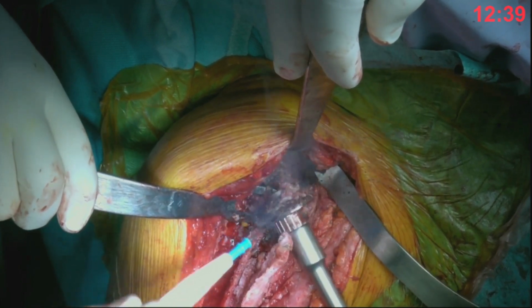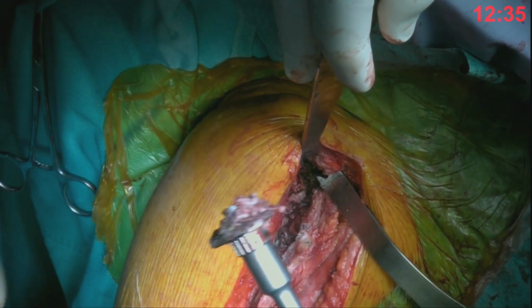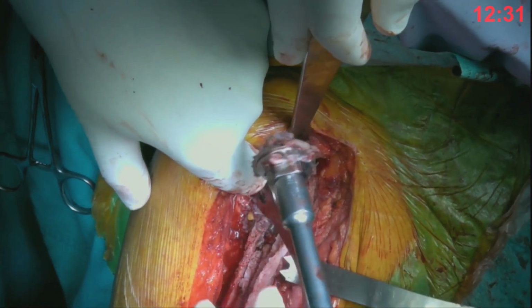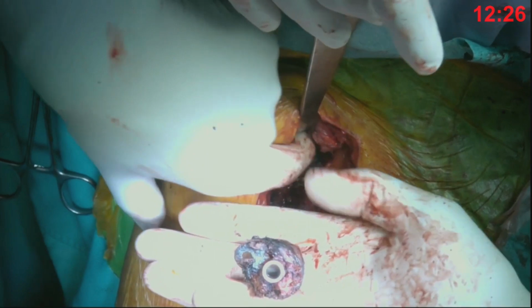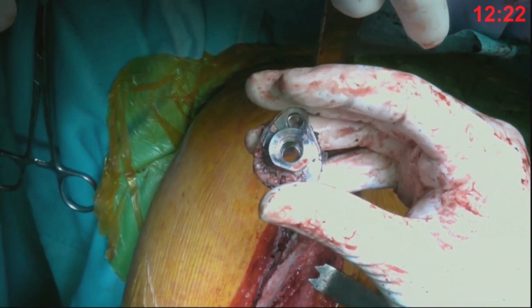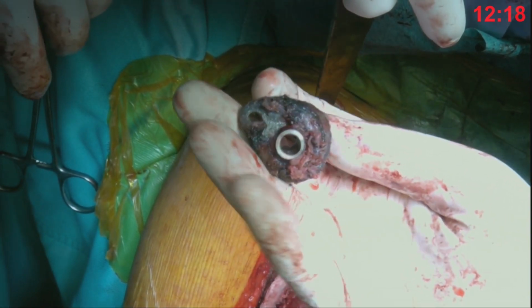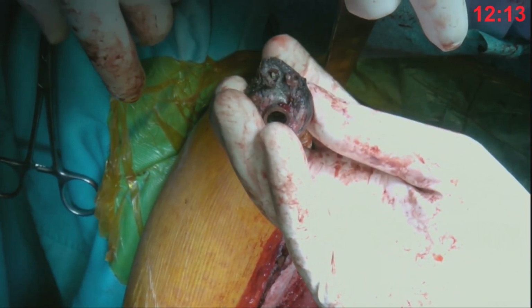And what about the screws? If you have the X-ray in mind; otherwise I show you the X-ray again. There are the tips of the screws that are broken and are in the bone. Because of the risk of unexpected infection, do you look for all the tips and try to remove them, or do you respect the bone and leave the tips of the screws in the bone?